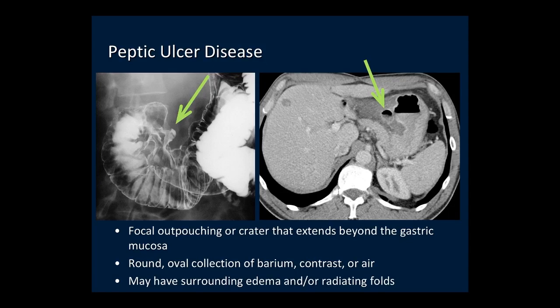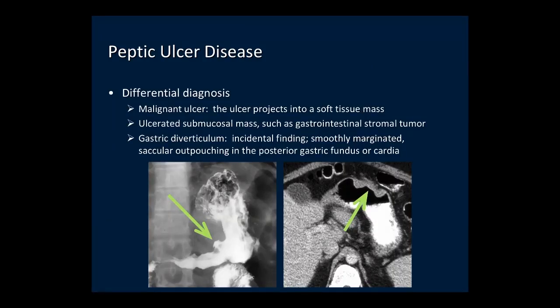On imaging, peptic ulcers are focal outpouchings or ulcer craters that extend beyond the normal gastric mucosa. On upper GI, we see an ulcer crater extending beyond the mucosa of the stomach. On CT, this ulcer crater contains air and fluid and extends beyond the normal gastric mucosa, surrounded by low attenuation edema in the gastric wall extending into the gastrohepatic ligament. The main differential diagnosis is a malignant ulcer, which is an ulcer within a mass. On CT, we can directly visualize the mass as soft tissue in the gastric wall with a central ulcer crater.